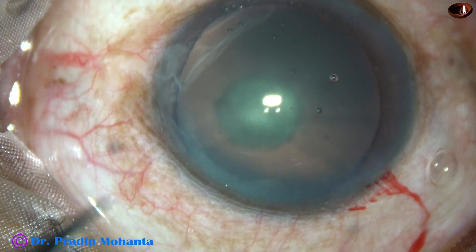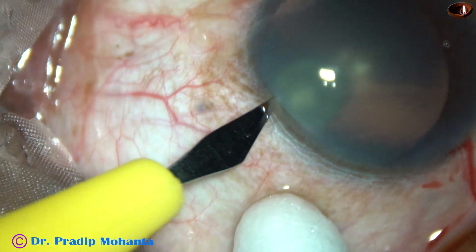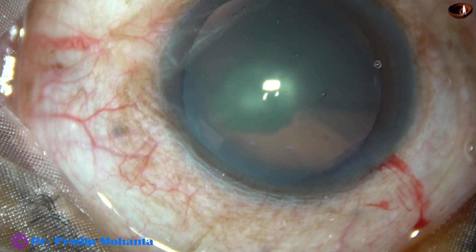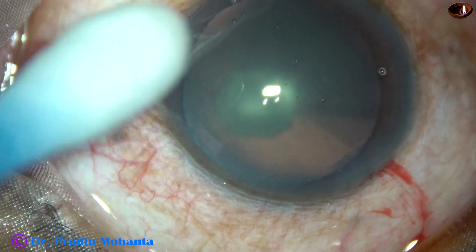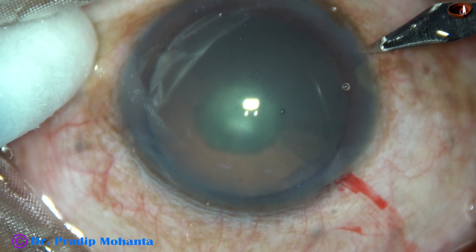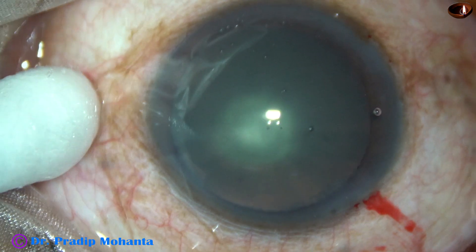This is a side port on the left side of the main incision, about 3 o'clock hours away. And this is another side port on the right side of the main incision, about the same distance away.